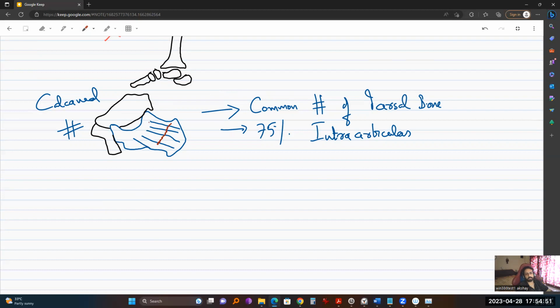It could be anywhere on the calcaneum, but always perpendicular. There is one fracture, there is another fracture, always perpendicular to the trabecular lines. If you see some other kind of sclerotic area that is not perpendicular to the trabecular lines, mostly it won't be a calcaneal fracture. So that is how you identify a calcaneal fracture.